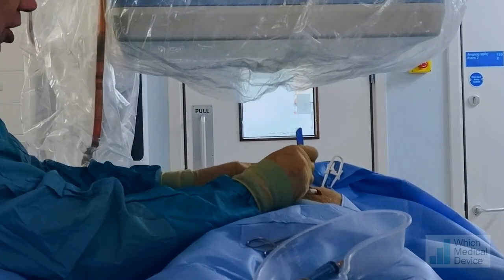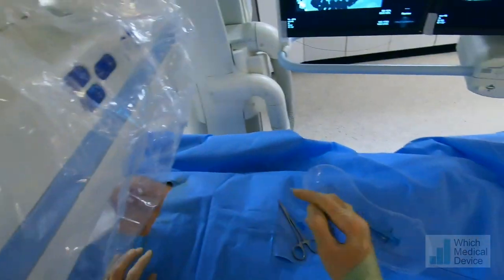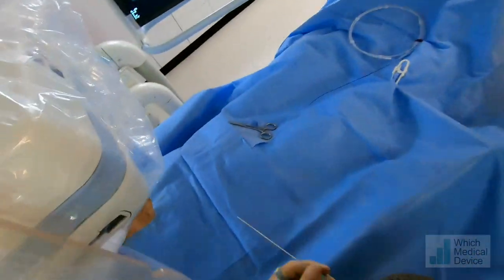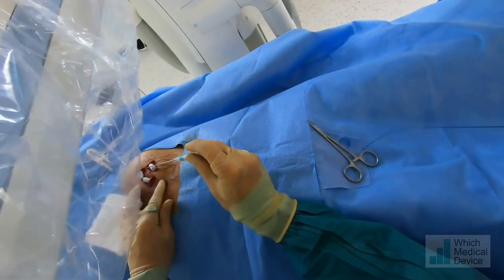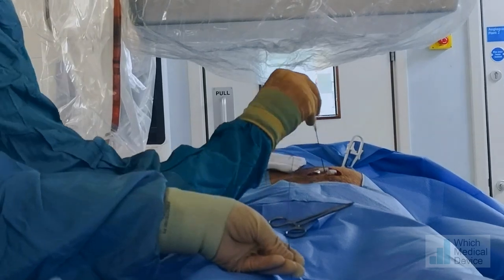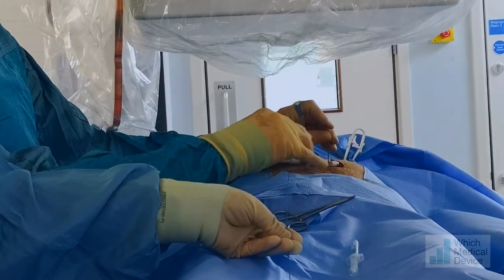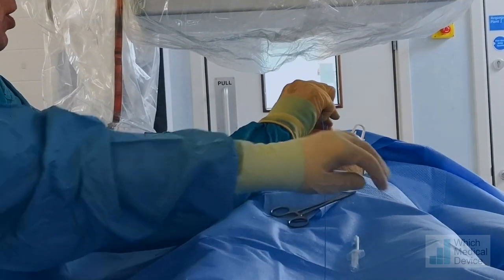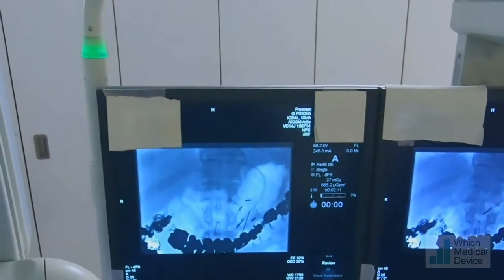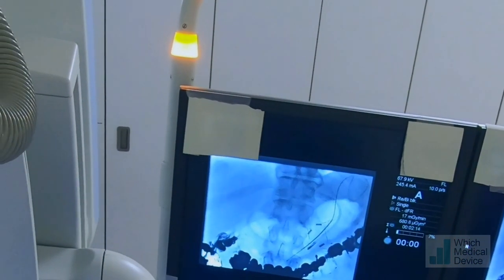I'm going to make a small incision for the gastrostomy tube. Now we're going back in with one of the needles from our T-fastener — you could use a Seldinger needle if needed. Checking position and angulation. We've got air back. We're now going to put an Amplatz Superstiff Guidewire in and pass it a good way into the stomach — you can see it coiled up in the fundus on the monitor.